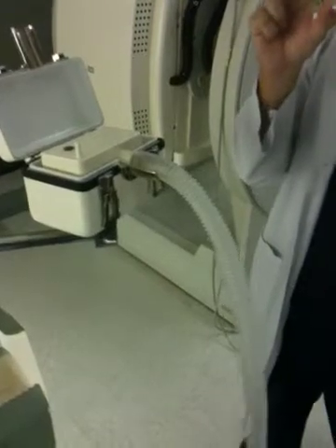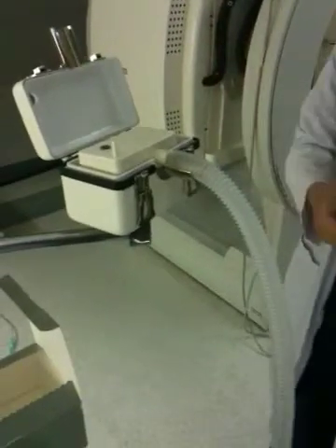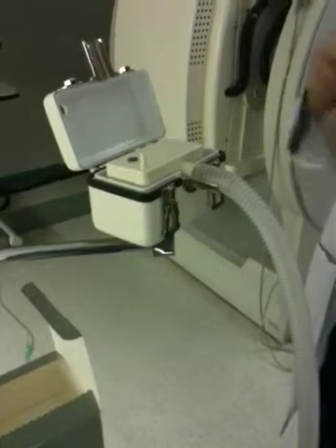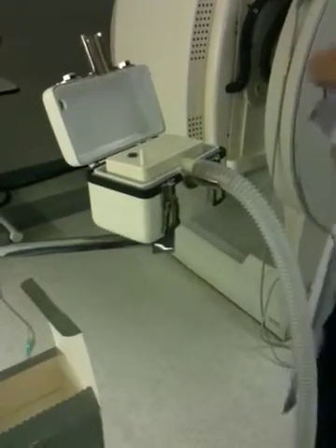The first thing you want to do is make 25 mCi of DTPA in a total volume of 2 mL only. That's going to be enough for you to create an aerosol — like a vapor — when you turn it on. So you make 25 mCi of DTPA in 2 mL, then you draw it out. Make sure you have a total volume of 2 mL.